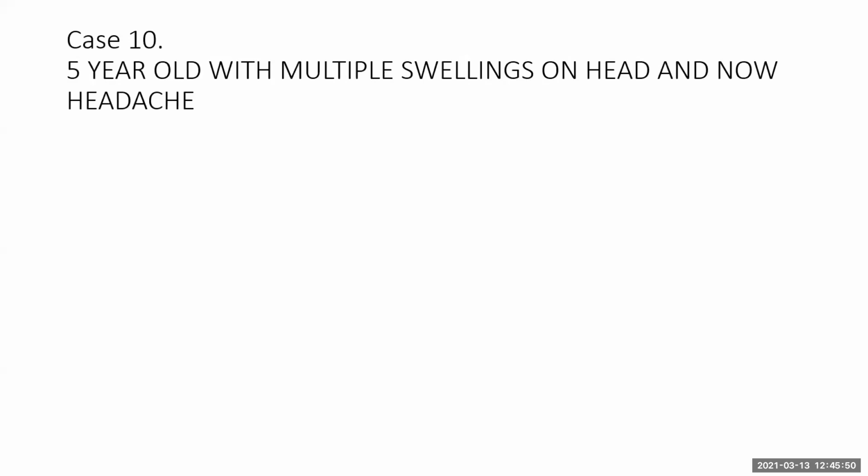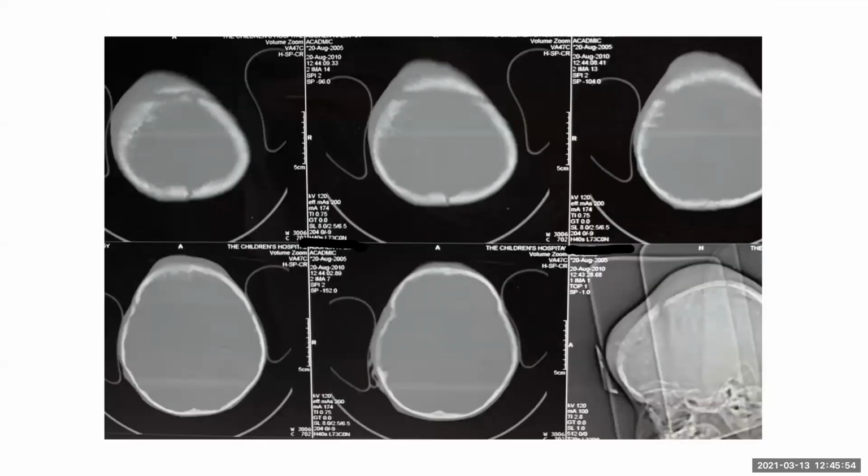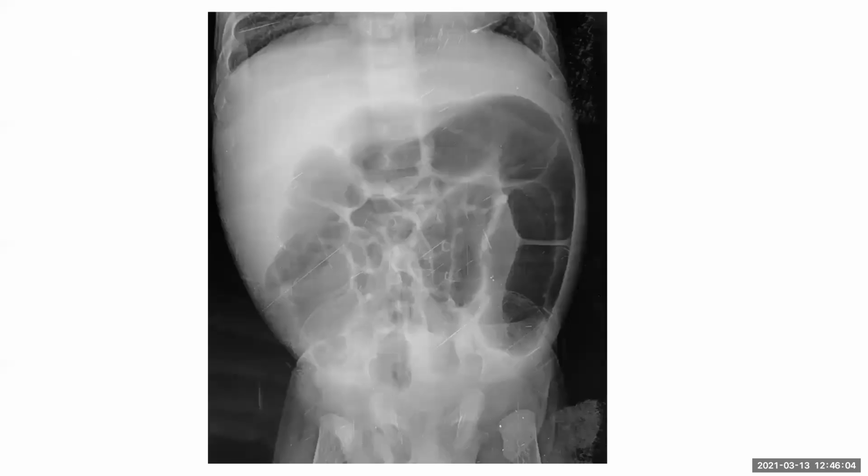Assalamu alaikum. Wa alaikum assalam. Okay, so this is our next case, I believe. Crying infant with distended abdomen, right?